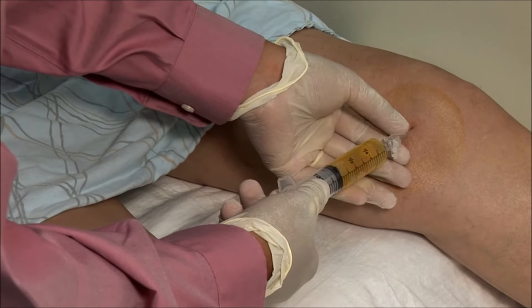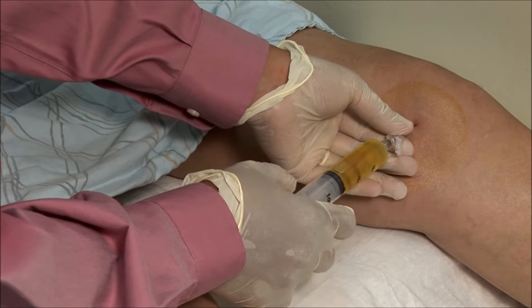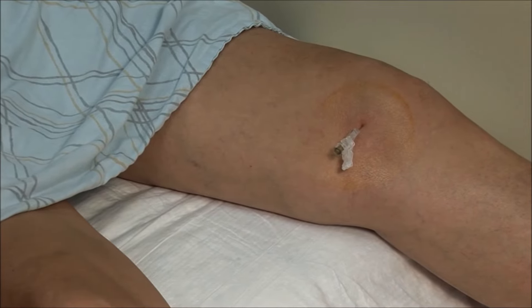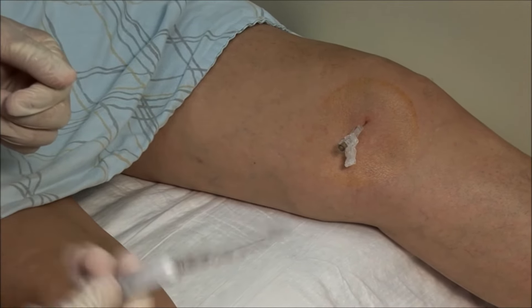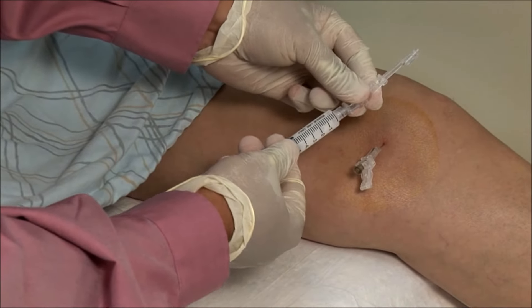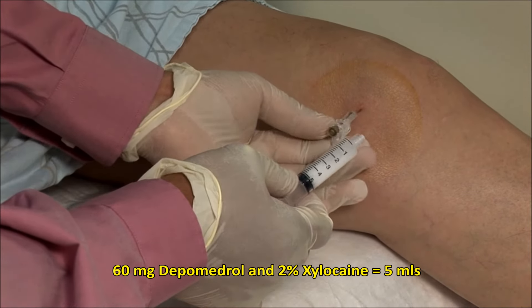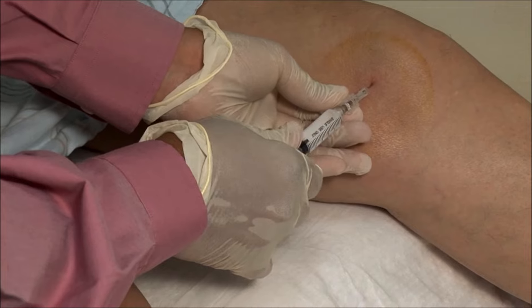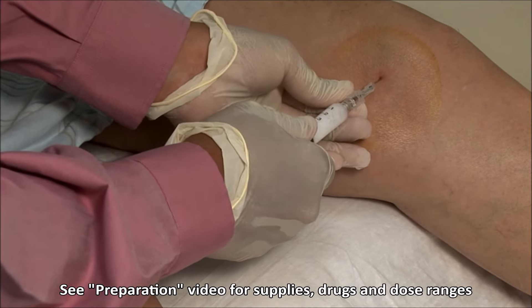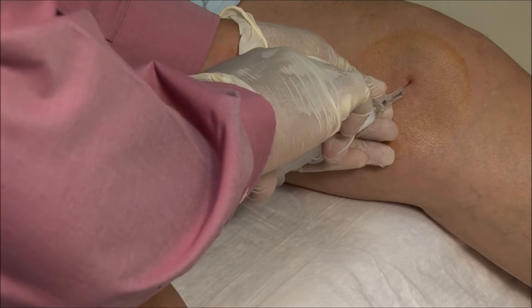Leaving the needle in place, you can switch syringes. Here I am injecting a mixture of 60 mg of Depomedrol with 2% xylocaine, made up to a volume of 5 mils. It should go in freely.